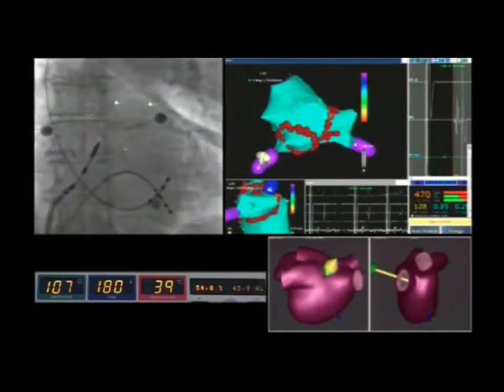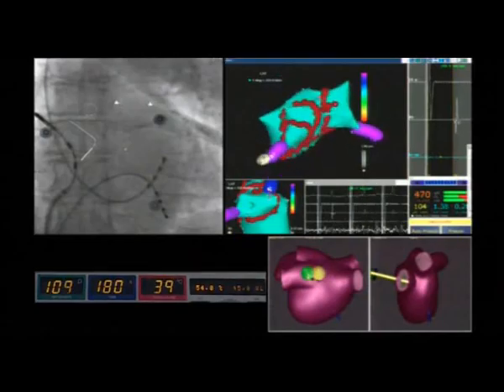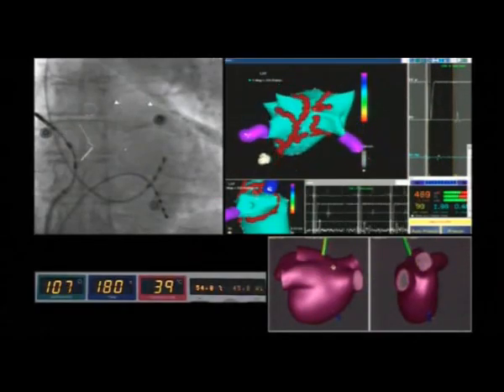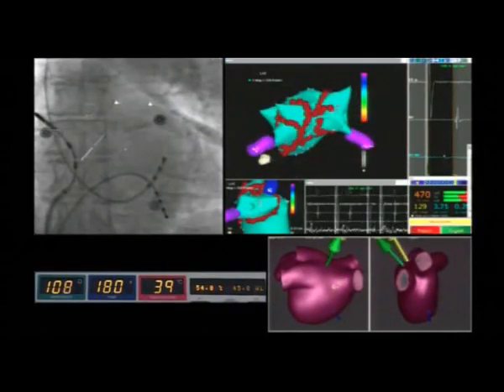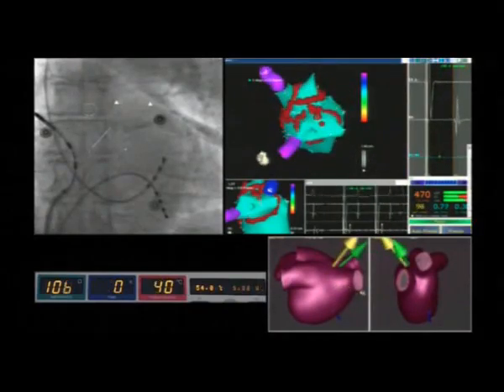Ablation lines are performed by sequential navigation to contiguous points with short applications in sequence to achieve a more than 90% reduction in the bipolar electrogram amplitude and/or peak-to-peak bipolar electrogram amplitude lower than 0.1 mV inside the line.